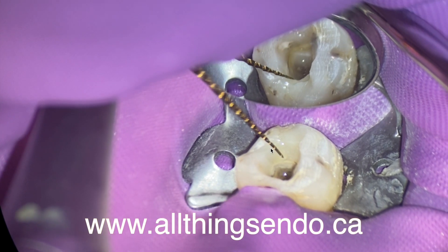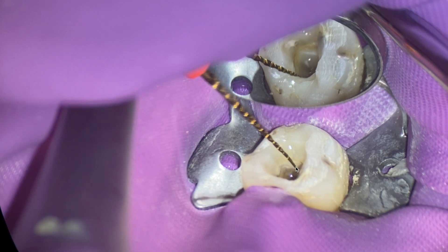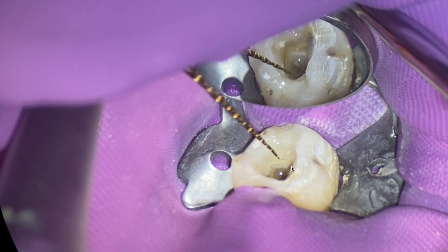And we're opening the coronal two-thirds, and even then we still had some unwinding of the flutes. So it's important to be able to pull your file out here and there once in a while through treatment, just to make sure you prevent a fracture down the road.